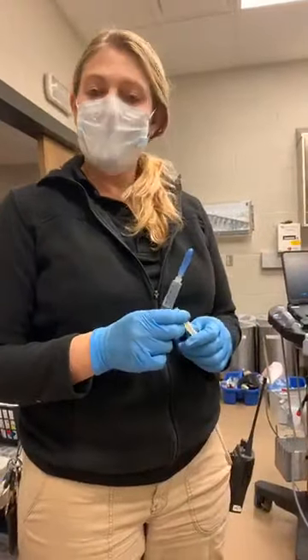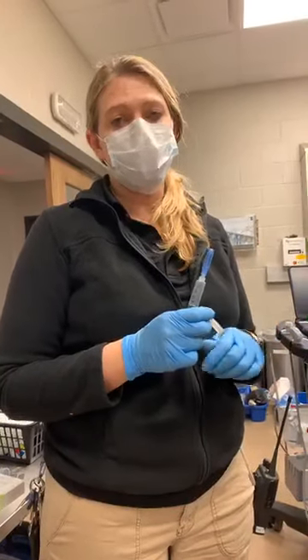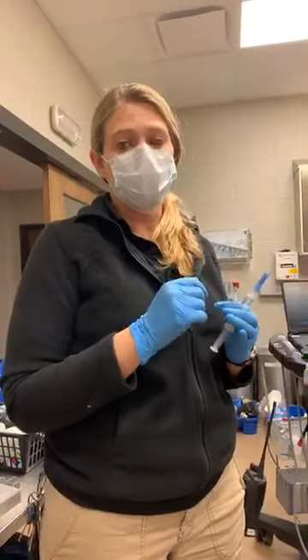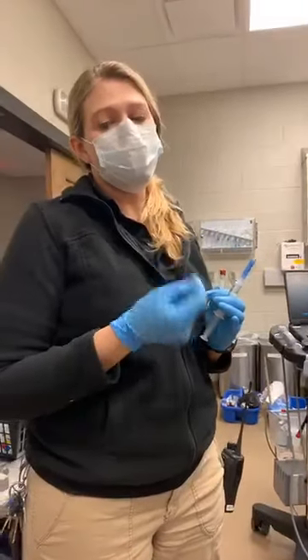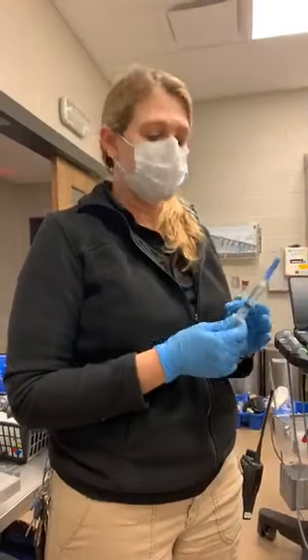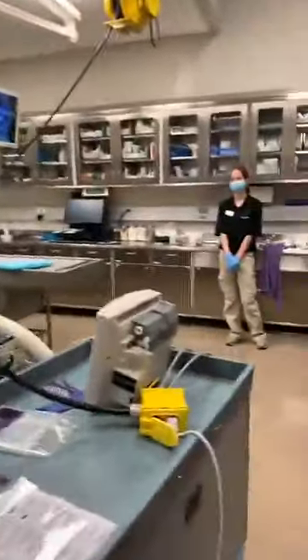So sometimes the wall of the bladder will get thickened, inflamed, so it should be a pretty thin wall. And then if there's stones in there, we'll see a reflection. So on the screen, the ultrasound screen, it's white and black. And stones, which reflect the sound waves, will be bright white. And so we might see little sparkly crystals. But we didn't see that today. So, great. All good. Great question. All right.